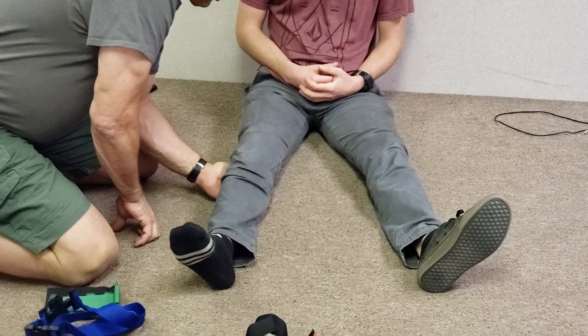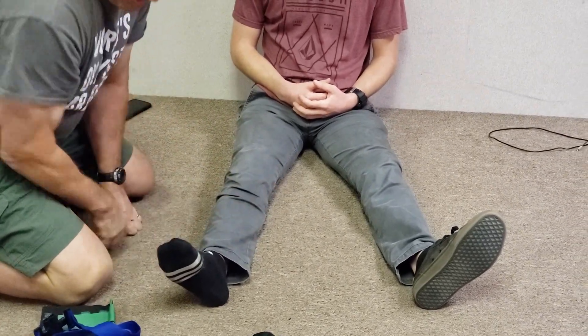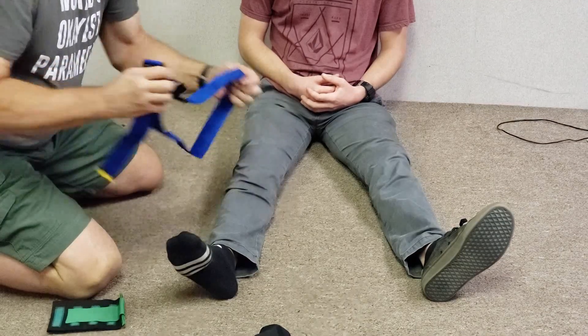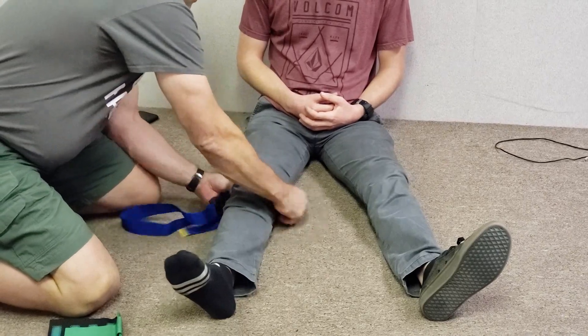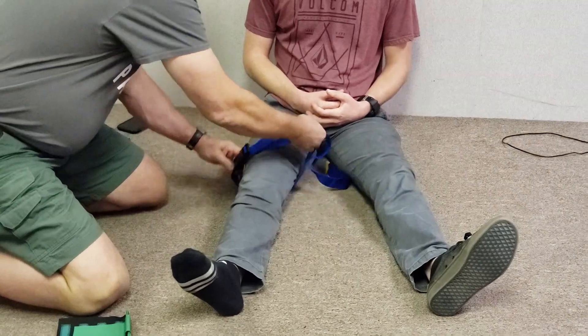Have someone take over traction for you. You'll notice I didn't measure the other leg like all the standard protocols do — I don't, because it's unnecessary. We're not trying to make the injured leg match the uninjured leg. We're trying to reduce the pain, and presumably reducing the pain is a result of more normally aligning the bone ends inside.